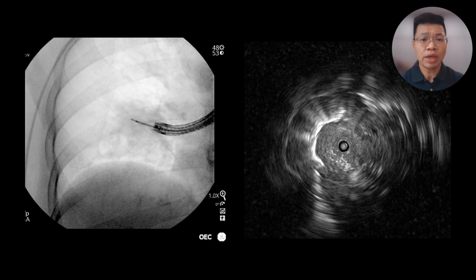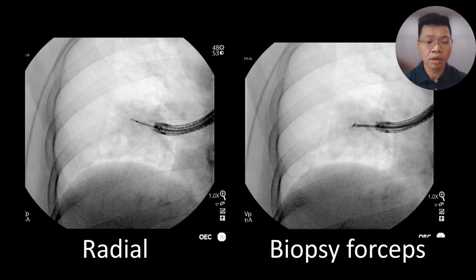In such a case, we can proceed with endobronchial biopsy under direct visualization, but my preference is still to perform a radial ultrasound to delineate the extent of the tumor and to correlate it on fluoroscopy. This allows me to wedge the scope in position to minimize bleeding into the airways during biopsy. You can see that there's a concentric radial EBUS image, as expected. We proceed to mark the radial length with a sticker and correlate the length to the biopsy forceps.